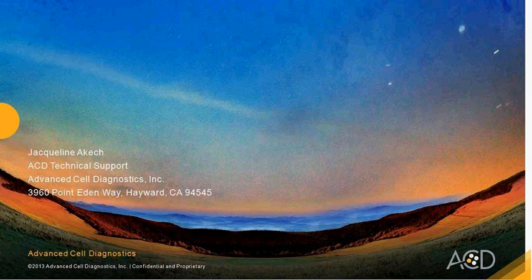For SuperFrost Plus slides, although they are charged, we have validated this consistently and shown that this allows samples to be fixated on the slide and sustained throughout the pretreatments in the assay. Therefore, I would ask for you to use EcoMount for mounting medium for 2.0 red and 2-plex, and SuperFrost Plus slides whenever you are mounting samples on the slide. If you receive samples that do not have SuperFrost Plus slides, then you should continue running the assay. However, if you have any issues with detachment, please call us in technical support and we can provide you with some guidance.